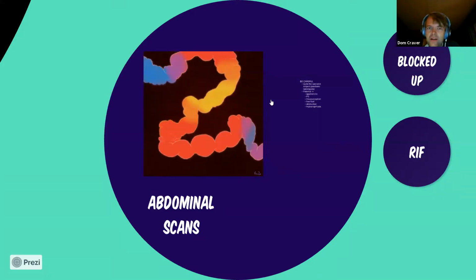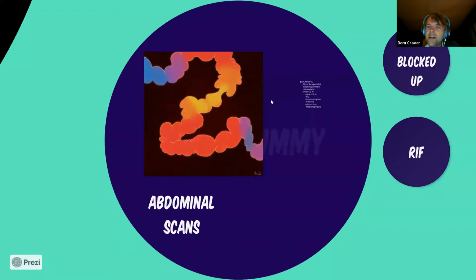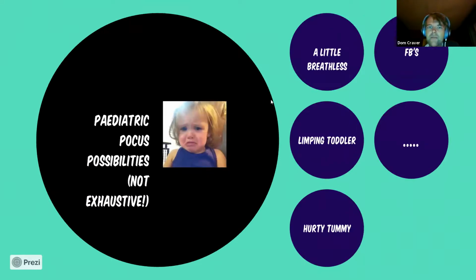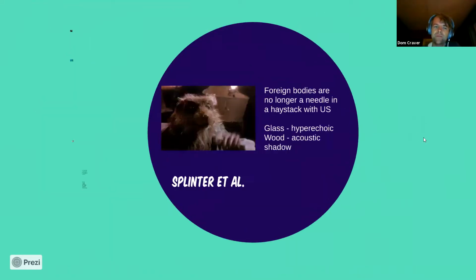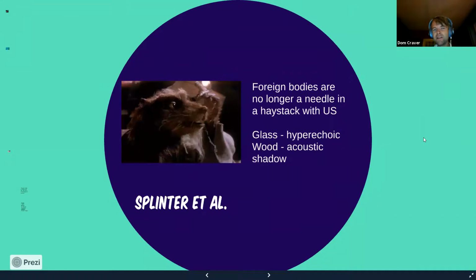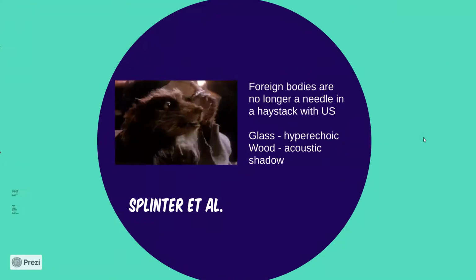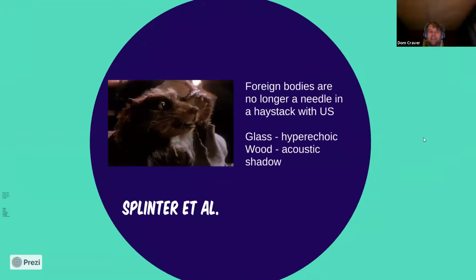Right, there's not much more. Let's see what we've got next. All right, yeah. So I think this is one of the final bits. So a bit about foreign bodies. Splinter, who remembers Teenage Mutant Ninja Turtles? Yeah, totally. So foreign bodies are always a bit of a nightmare.